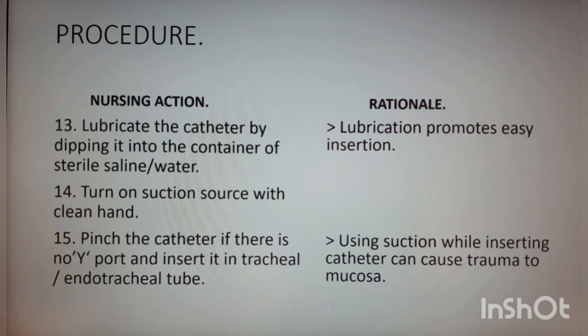Next, lubricate the catheter by dipping it into the container of sterile saline or water. This can be done except for a silicone catheter. Lubrication promotes easy insertion. Silicone catheters do not require lubrication. Next, turn on the suction source with the clean hand.